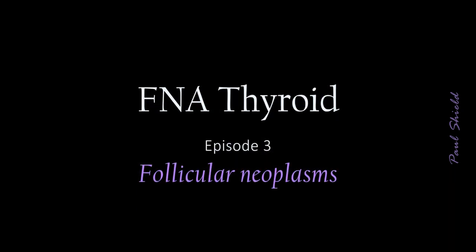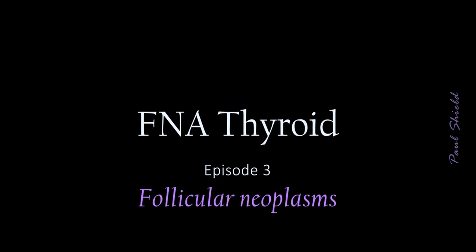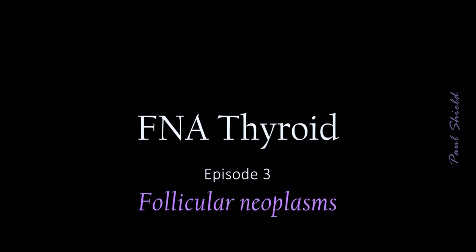Hi, it's Paul. In this clip we're going to look at an example of a follicular neoplasm. So the major difference that we notice with these as opposed to a normal pattern is a predominance of microfollicles and an absence, or else a very small amount, of colloid.